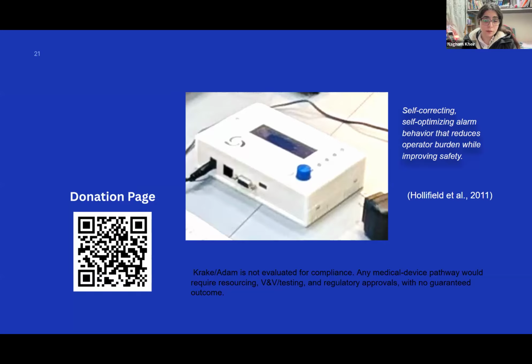And it can go further than that by analyzing this report and giving you suggestions to edit the configuration. And that would be a result of enhancing your alarm. What does this mean? When we mentioned the bad actor report, when you read that, you'll notice as if you've caught the bad guy, right?